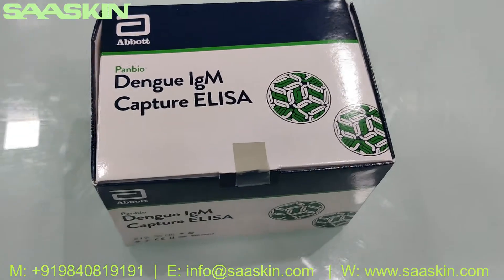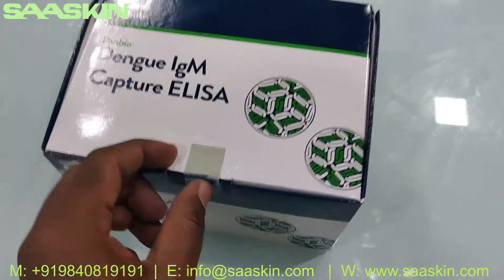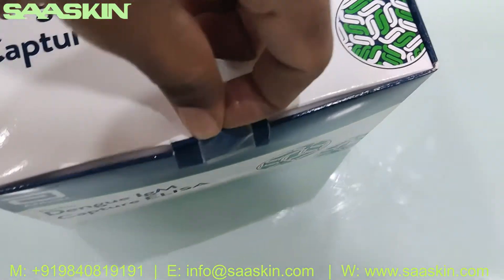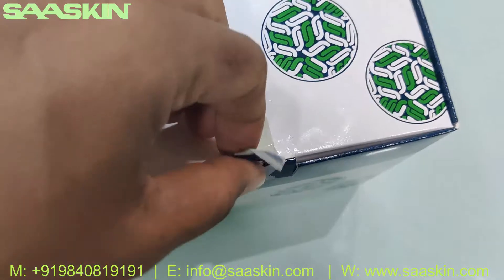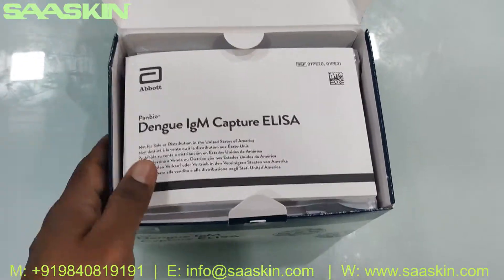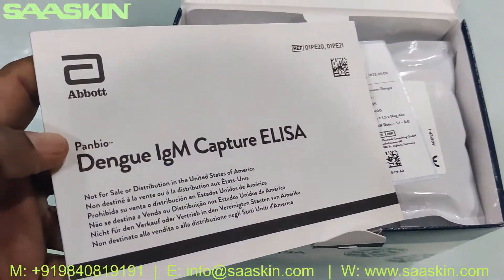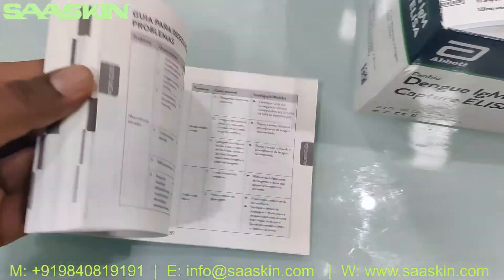This is how the kit looks like. Let me unbox this for you. Okay, got it opened. Inside the box you have a complete booklet for this Panbio Dengue IgM Capture ELISA — you can see the complete procedures and instructions are given here.